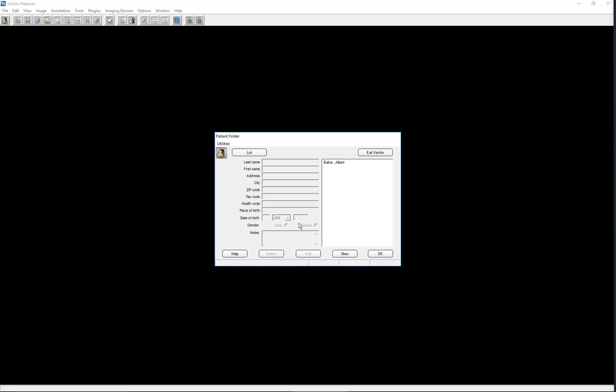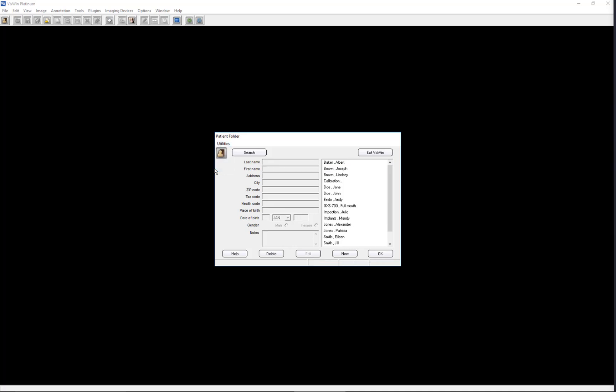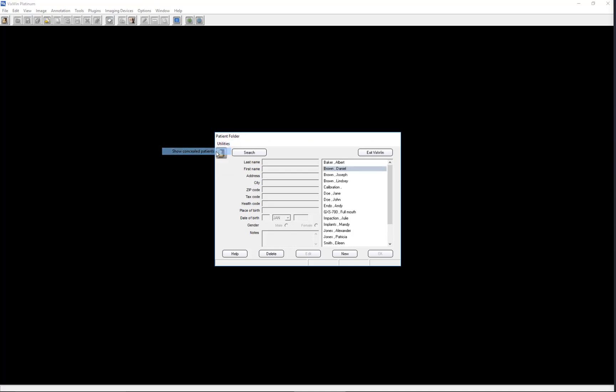Additional functionality exists to conceal names in the patient folder. Let's select a patient to be concealed. Click the Utilities button, then click on Conceal Selected Patient. The patient is no longer visible or available to open. To restore the name, click the Utilities button and click Show Conceal Patients. We now see the patient record that was hidden from view.